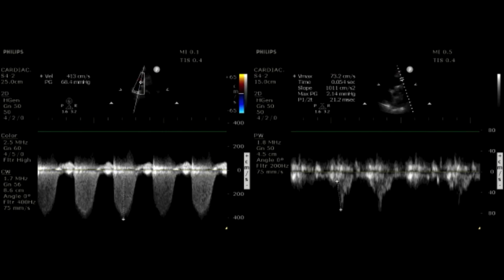Great. Well, thank you for this time. I guess just to wrap things up a little bit here, we talked about a lot. Very helpful, kind of filling in, kind of explaining how this all works. Ashish, thank you for that. So we talked about right heart pressure, right heart strain in PE, what's causing it, the different echo parameters, and the 60-60 sign that we can use.